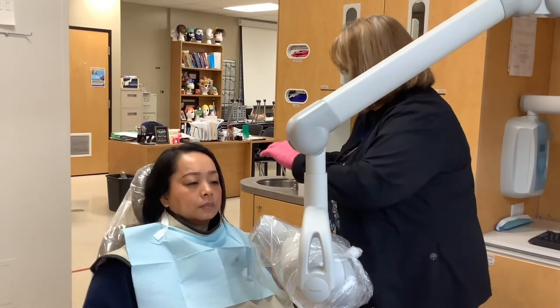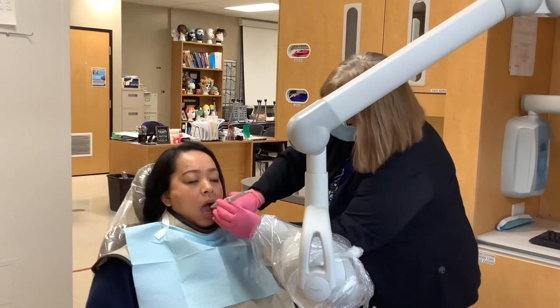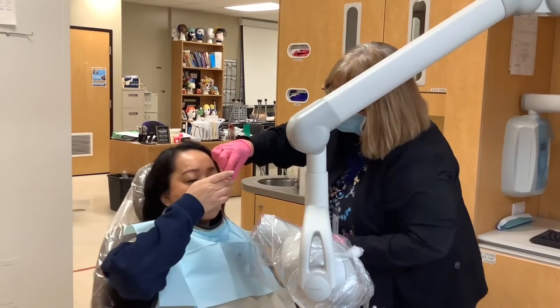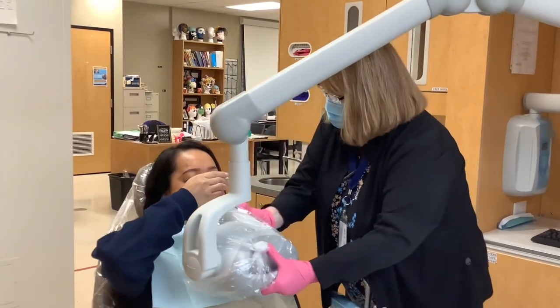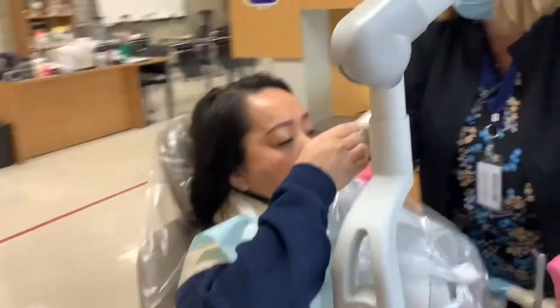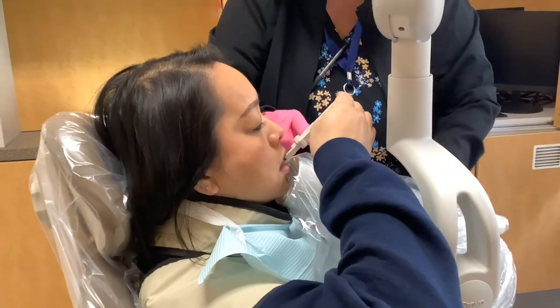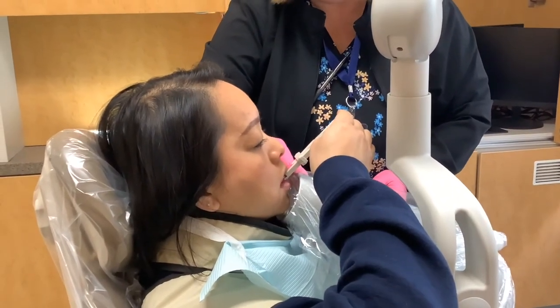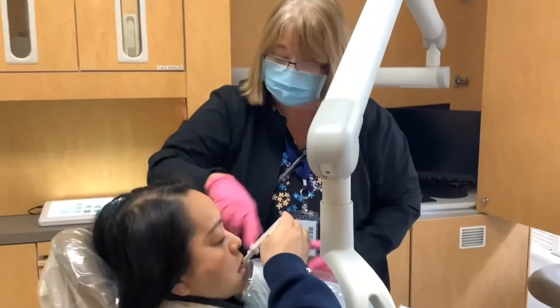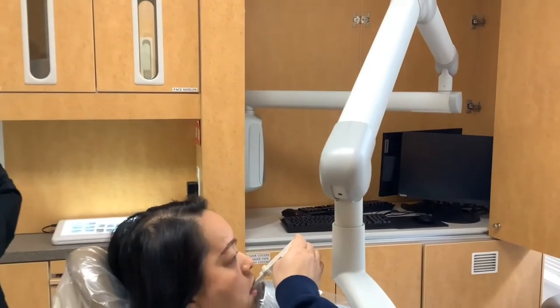Last one — the lower centrals. I'm going to go down under the tongue, hold it up, right underneath my chin. You can see the angle of the x-ray head — the beam is coming out. I'm going to get the end of the x-ray right here, and my apex down here should get everything in that shot. And we'll show a picture of an x-ray like that.